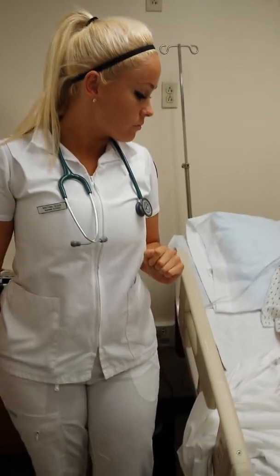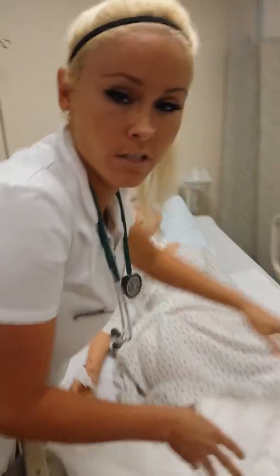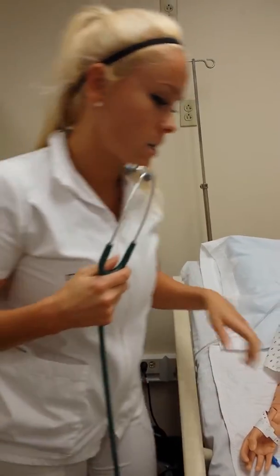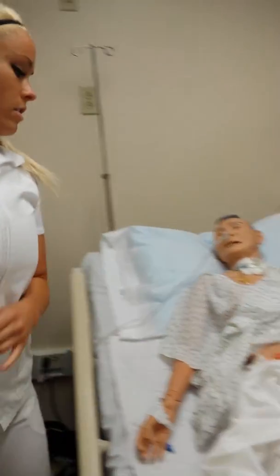I'll be doing my PEG irrigation validation. First, we're going to stop any bolus feedings 30 minutes prior. If the patient's on bolus feedings, whatever the doctor's order says will determine the timing.